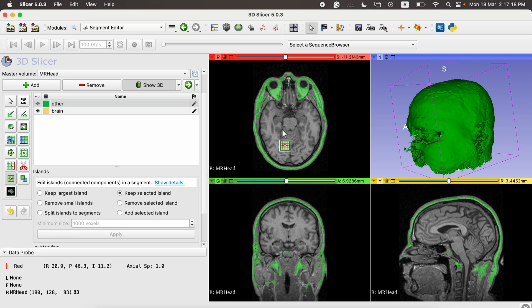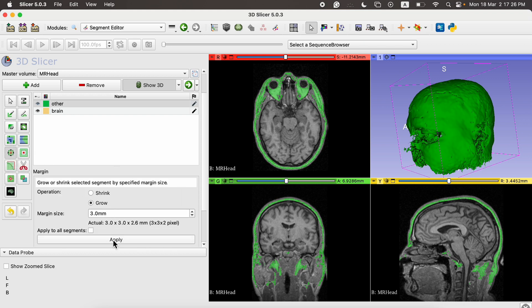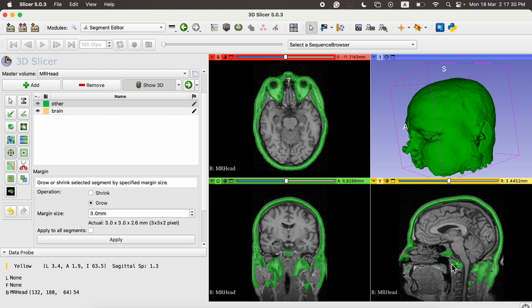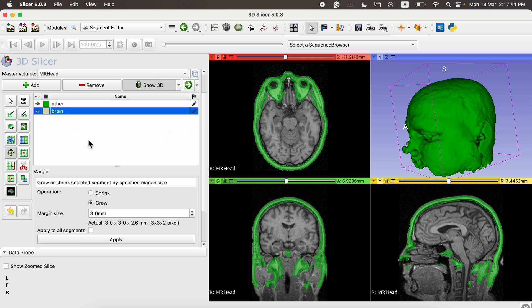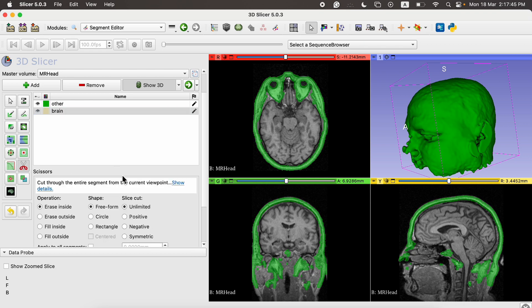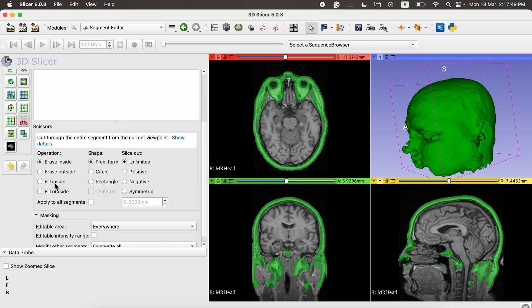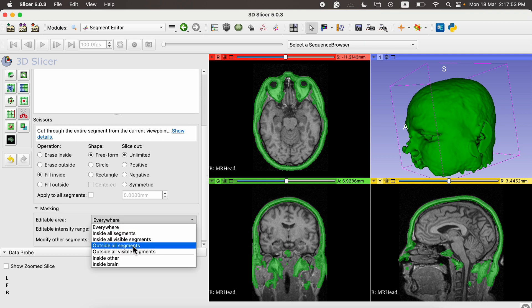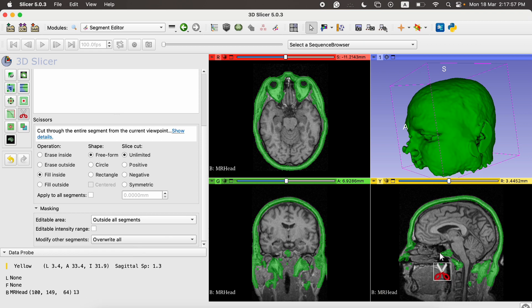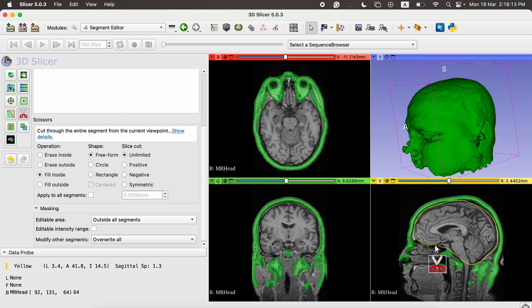Once we click the Island button it delineates the brain region and we are left with only the artifacts. Next click the Margin button and click Grow to expand and capture all the artifact regions we want to delineate. Once satisfied, click the Brain button to switch to the brain segmentation. Click the Scissor button, select Fill Inside, and in the editable area select Outside All Segments. Then draw around the brain region and press Enter.